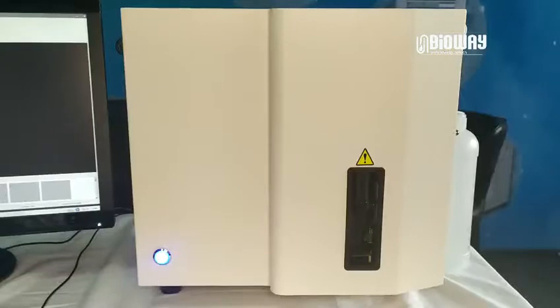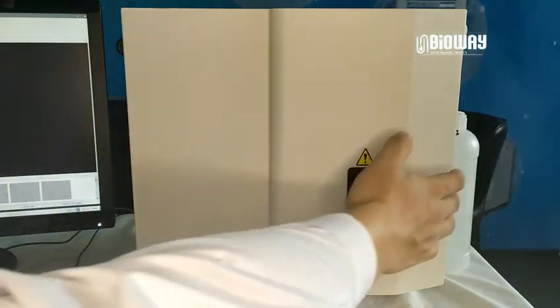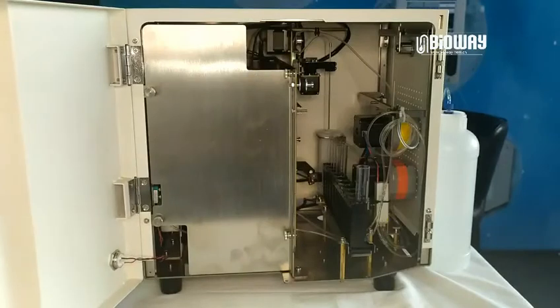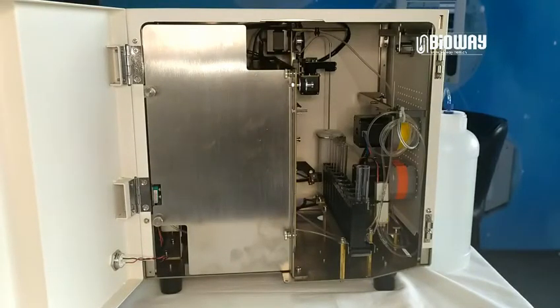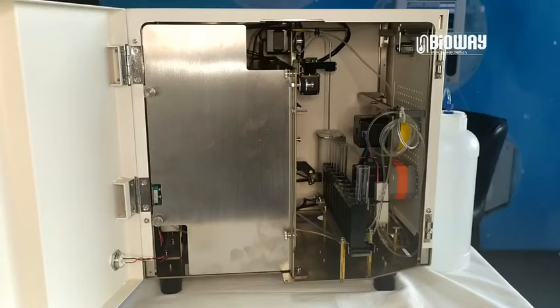First, I want to demonstrate the inner working process of BW2000 while it is testing. Open the front case, then click test. We can then observe the movement of the urine sample during testing.